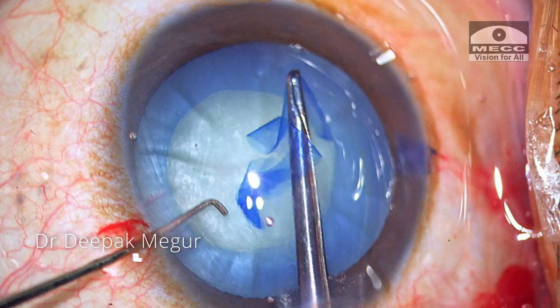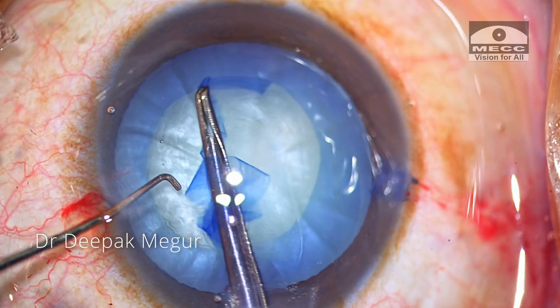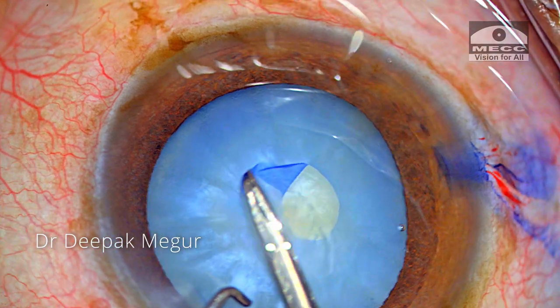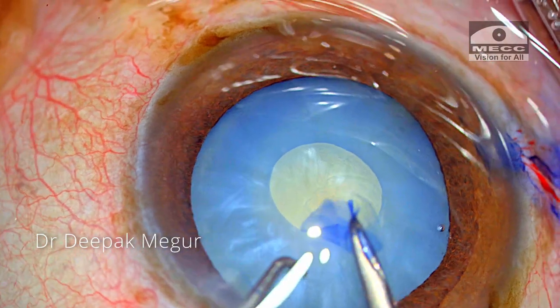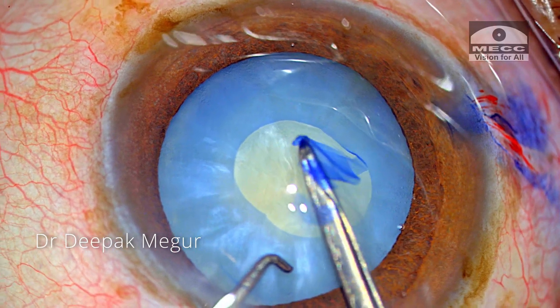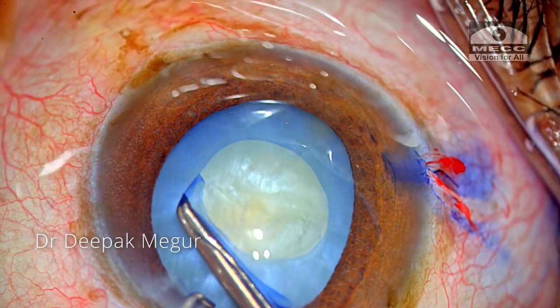With this technique, the job gets done faster since it's completed in one go in most cases, compared to the classic two-stage rhexis method wherein I need to go in and come out a couple of times. We now have a perfectly sized and centered rhexis. I may also use this spiraling technique to create the smaller primary rhexis in a two-stage rhexis, because in a very swollen lens even creating the smaller rhexis is challenging due to high intracapsular tension. This spiraling technique gives better control even while creating a small primary mini-rhexis in the two-stage method as well.